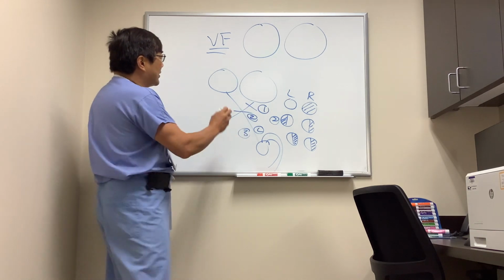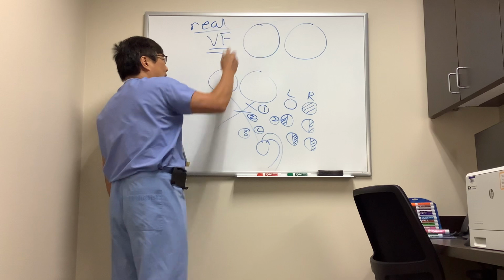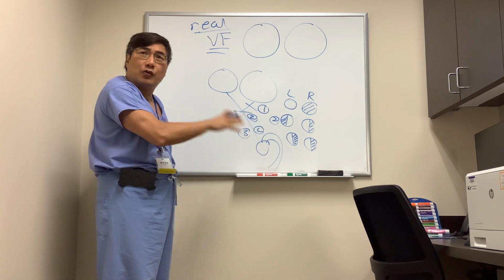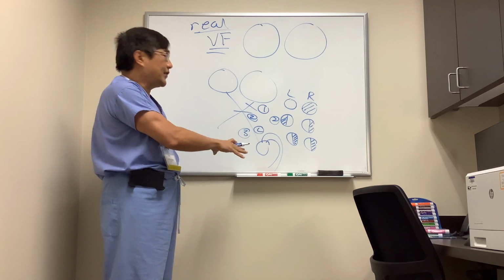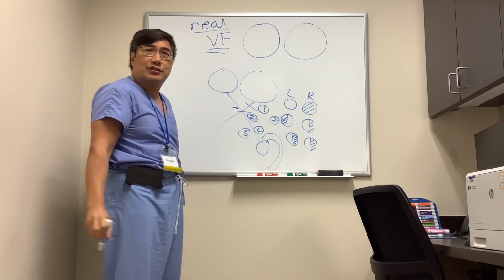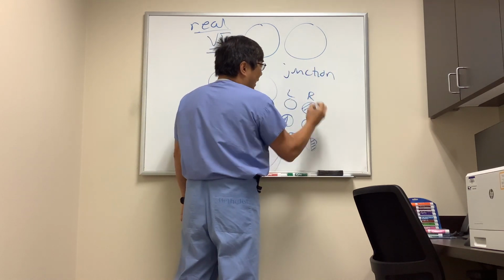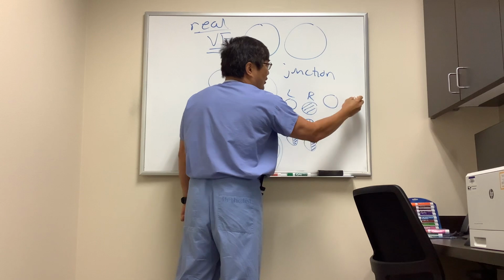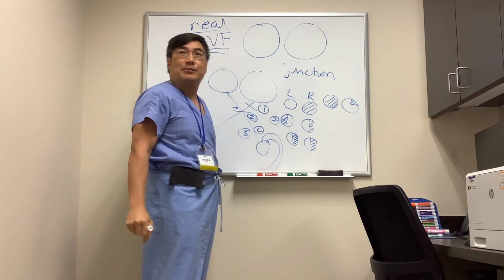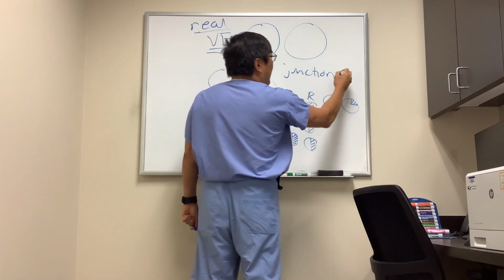But you should know that there's visual field defects in the real world that are difficult because they don't look like the typical normal book versions of the fields. And one of those is right here, which is the junctional scotoma, which is at the junction of the optic nerve and chiasm. And in the book, the way the junctional scotoma is drawn is like this. The whole thing is out, and then you have a superior temporal field defect. Well, that's so obvious that that's a junctional scotoma.